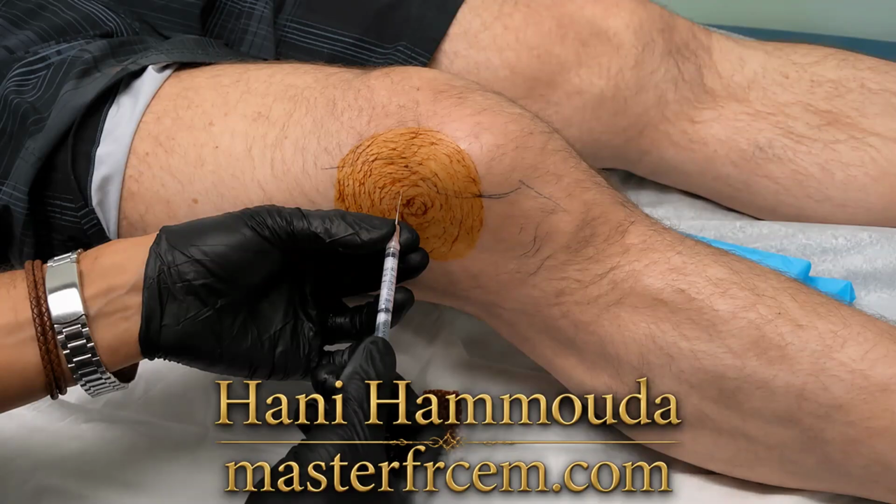Then you gather your equipment. You have two needles. You have the small needle, 22 to 23 gauge, for injection of the skin and subcutaneous tissue with local anesthesia. Then you got the large needle, that's the 16 to 18 gauge. That one is used for aspiration and sometimes to give medications like steroids. Then you also have your normal saline, your syringe, your gauze, your drapes, intralipid, just in case there is a local anesthetic toxicity. Do you follow? Beautiful. All right, so let's talk about the procedure steps.